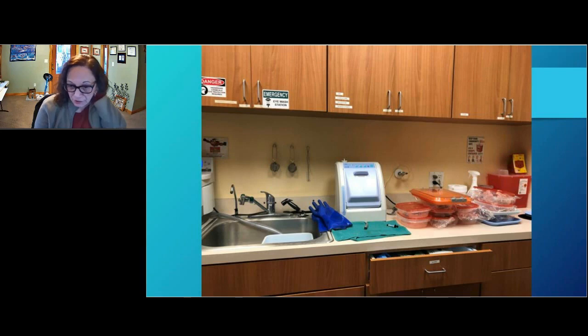So this is actually what you saw when it was in use. You walked in, instruments would be piled, handpieces might have been cleaned and sitting here. In this particular practice, they actually had a backtrack. They would take the handpieces here to the sink to wash them under running water per the manufacturer's instructions, dry them, put them on the lubricating machine, then let them sit until they were ready to be packaged.